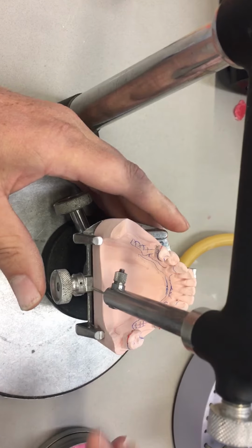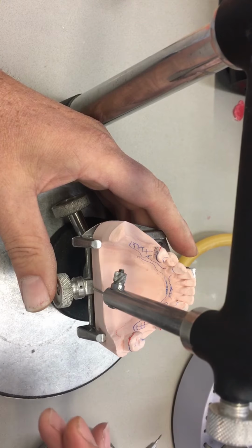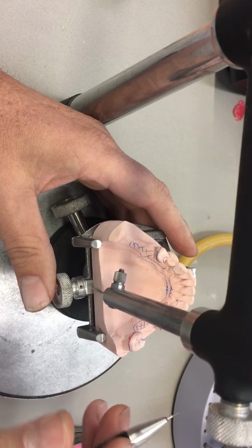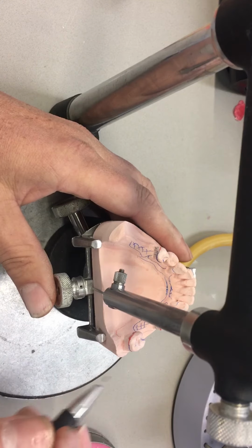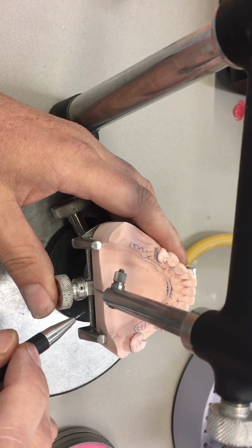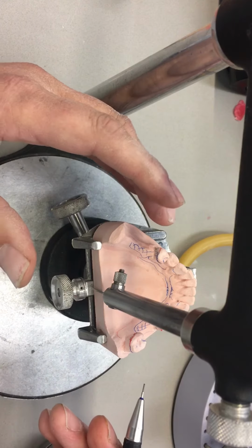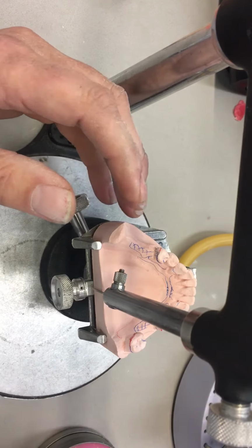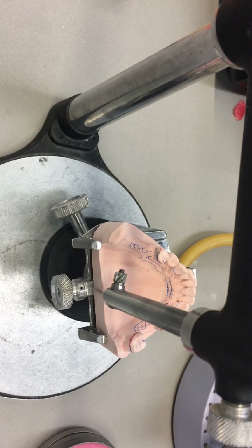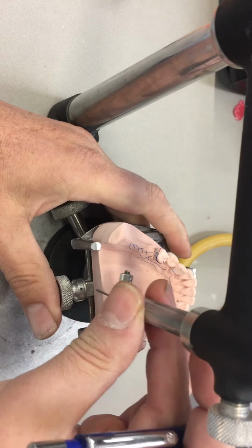Okay, so here we are on part 2 of the Kennedy Class 2 Modification 1, Project 4. This is the one that I just did the drawing for, and we're going to do the analog for you now, the blockout and the digital. Before doing the drawing on the model, I took the liberty to survey the abutment teeth, which helped me design the cast framework design on paper for the prescription. And then I transferred that onto the model already.